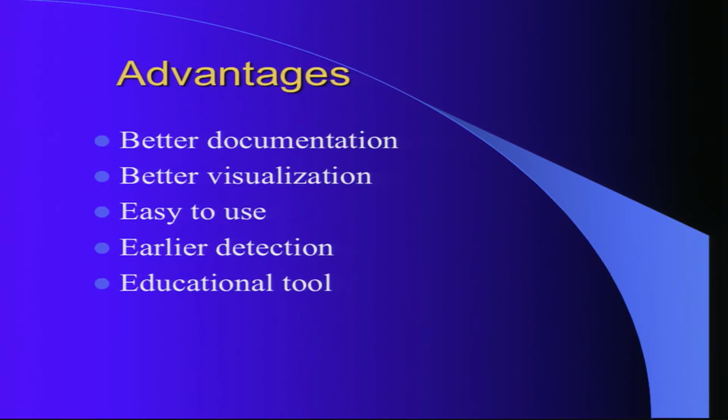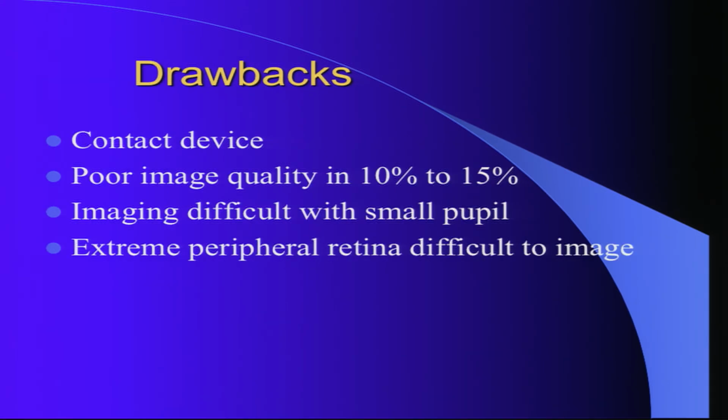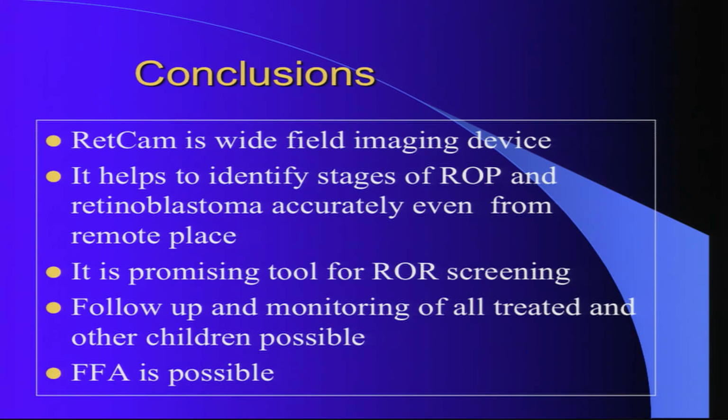I can go on, but you see this is an instrument which definitely helps us in better documentation, visualization, and making decisions, as well as being a great educational tool. But it's a contact device. A small pupil may be a problem at times. It may be difficult. So with this I conclude that RetCam is a wide field imaging device, especially useful in infants.